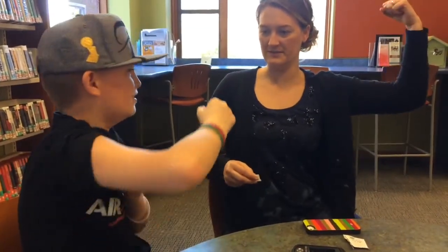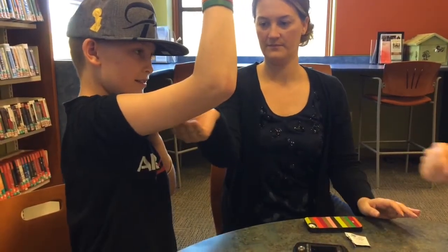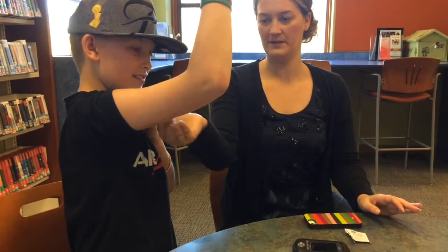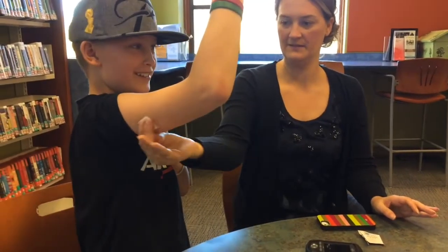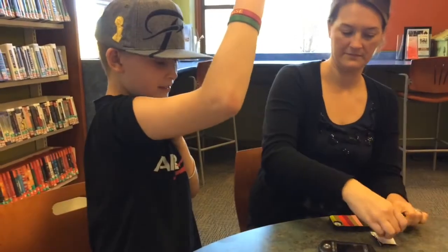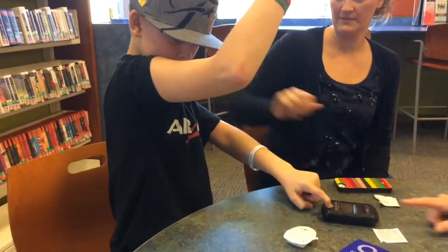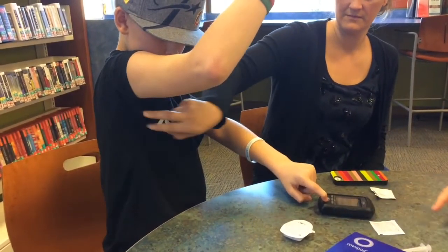So put your arm up — right here. Exactly. And you don't want to go real close to your armpit. Right there. Perfect. It's more on the inner part. There's no right or wrong way, but we can get some problems. Good job, sweetie. And then now we can go ahead — if we take off your tape backing.